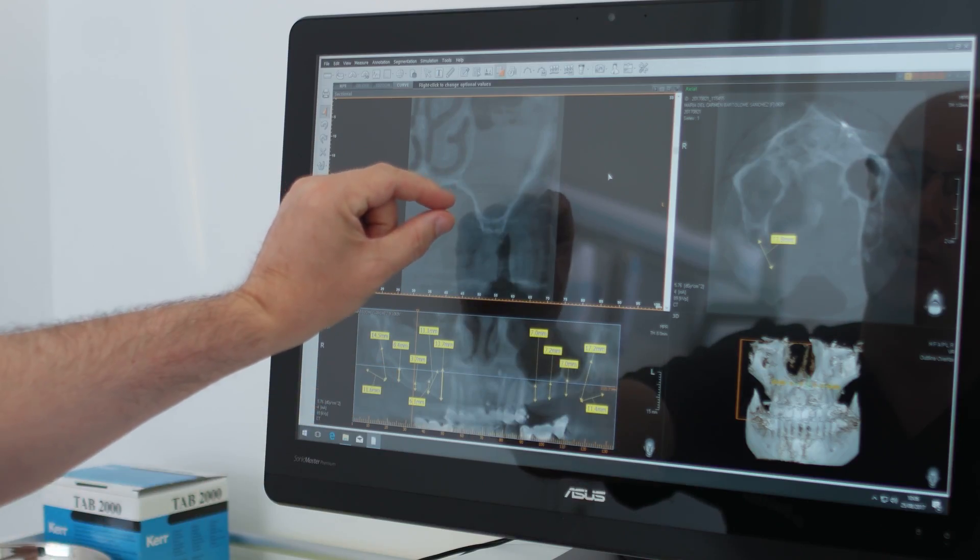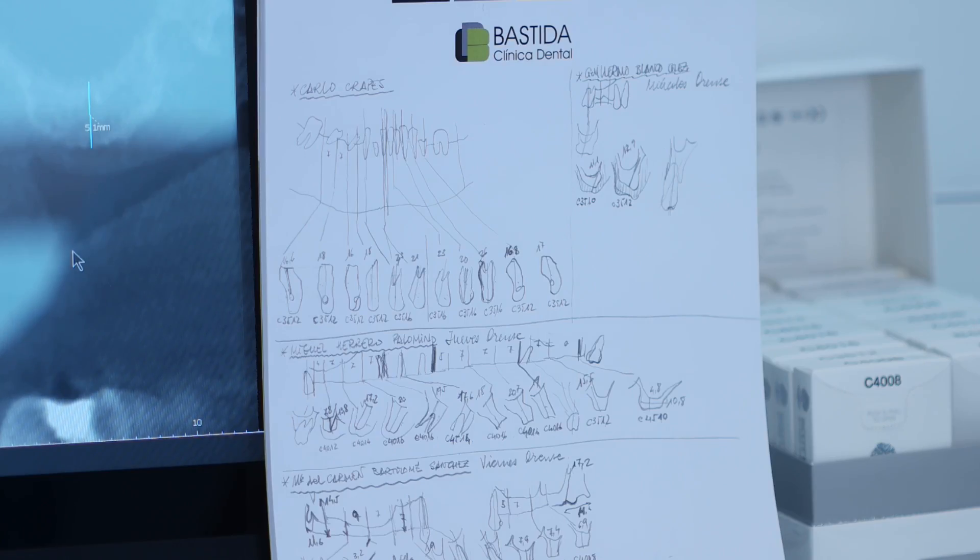Today I'm going to place nine implants in the patient and I expect it to take one hour and a half. It was necessary to finish all the process in one day because this patient needed to take a flight to Barcelona. Okay, let's do it.